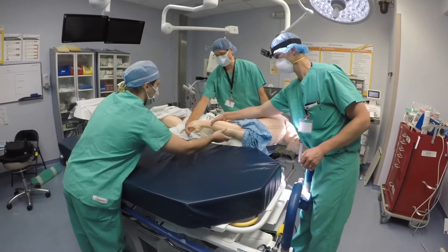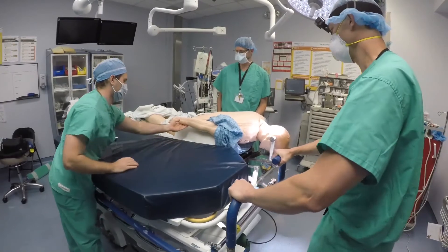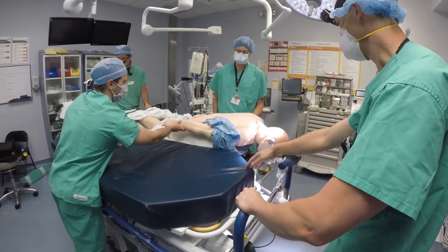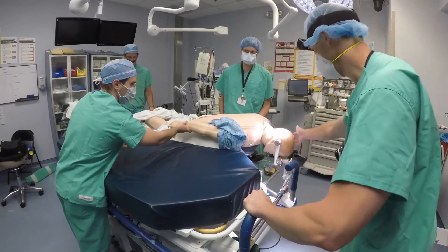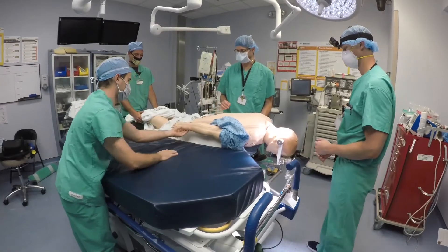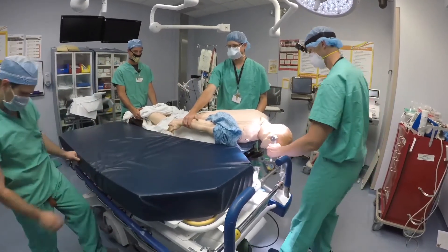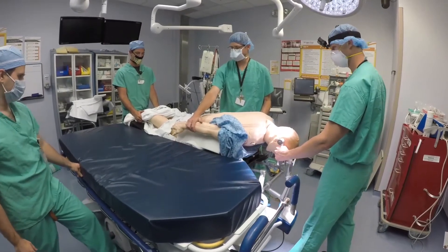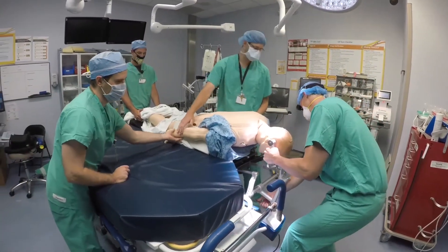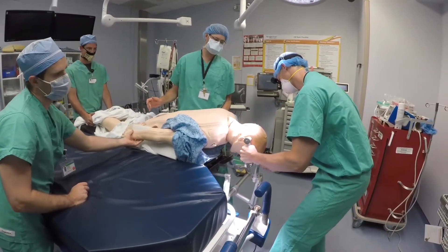Now we're adjacent here, so we've got the bed as close as we can. You want to make sure the head is lined up with the head of the bed — you always tend to lose altitude, so if the head's a little bit above, that's good. Make sure the bed is low enough so you let gravity work for you. Lower the bed a little, then disconnect the Mayfield from the adapter — three, two, one — always maintaining good order.